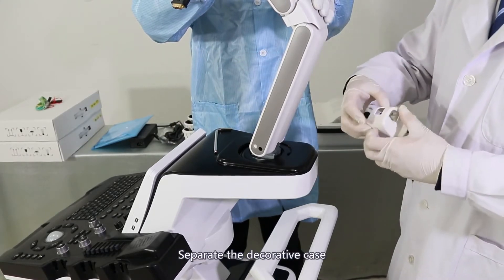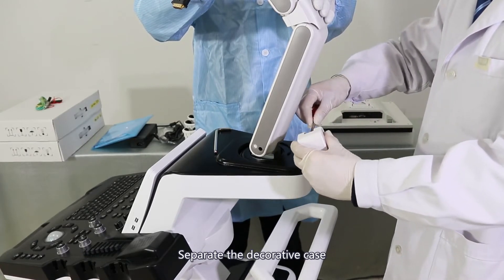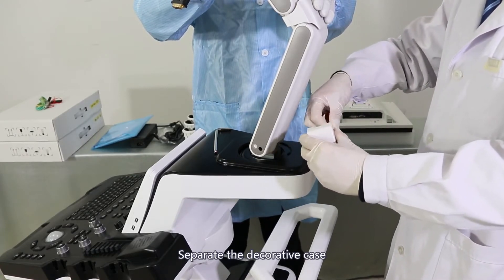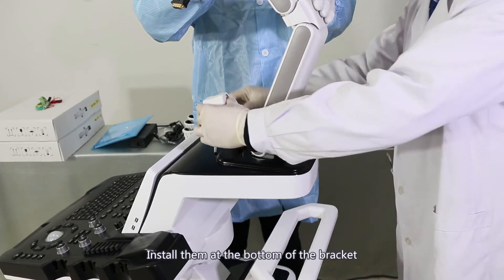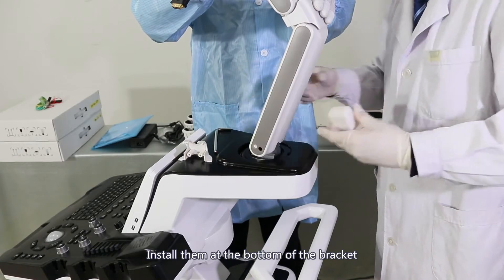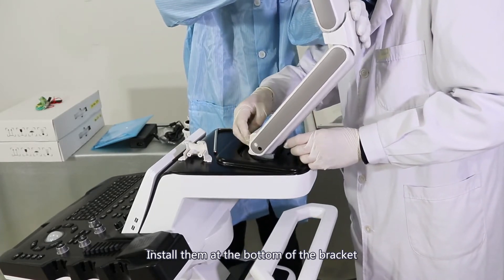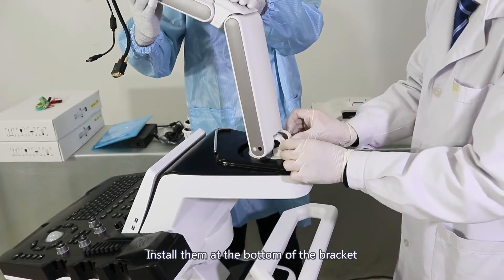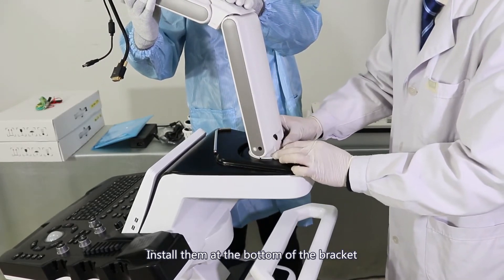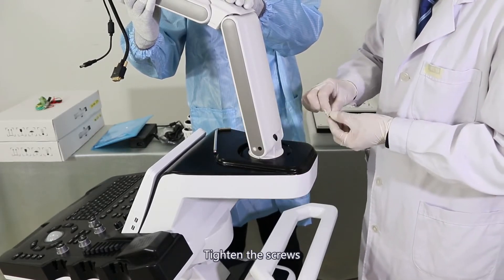Separate the decorative case and install the pieces at the bottom of the bracket. Tighten the screws and secure the base.